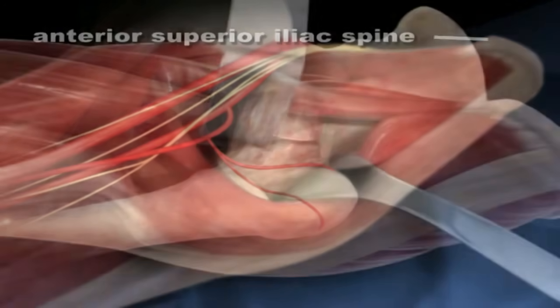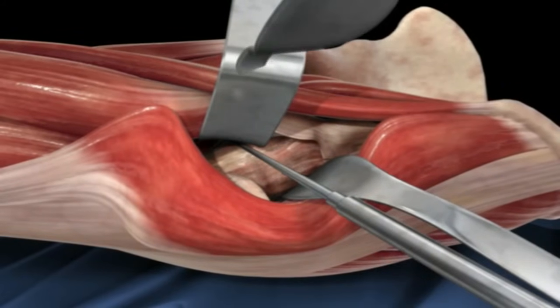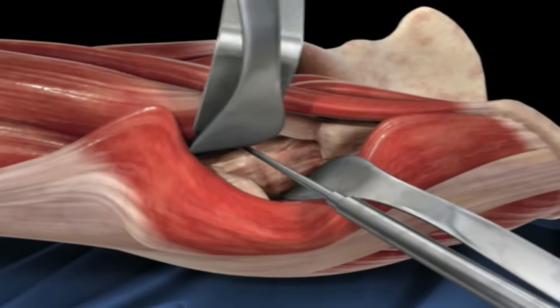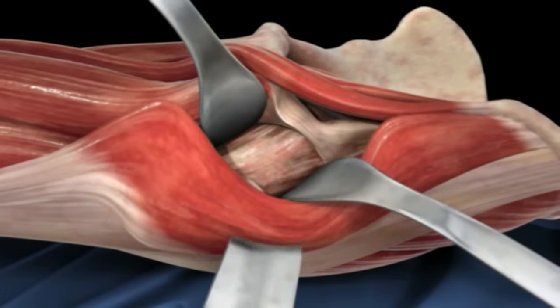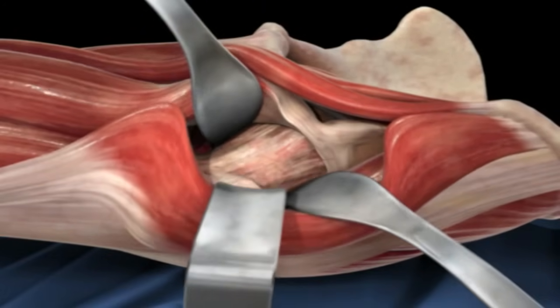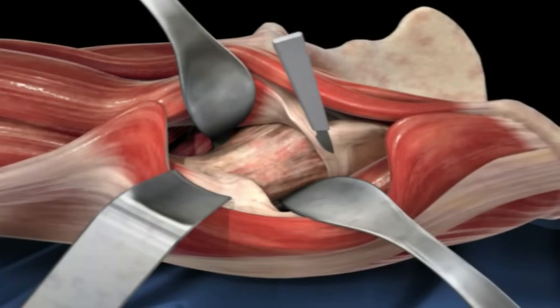Next the animation jumps to the surgical procedure showing retractors being placed around the hip joint. What is unique about the direct anterior approach is that none of the muscles around the hip joint are actually released or cut during this procedure.